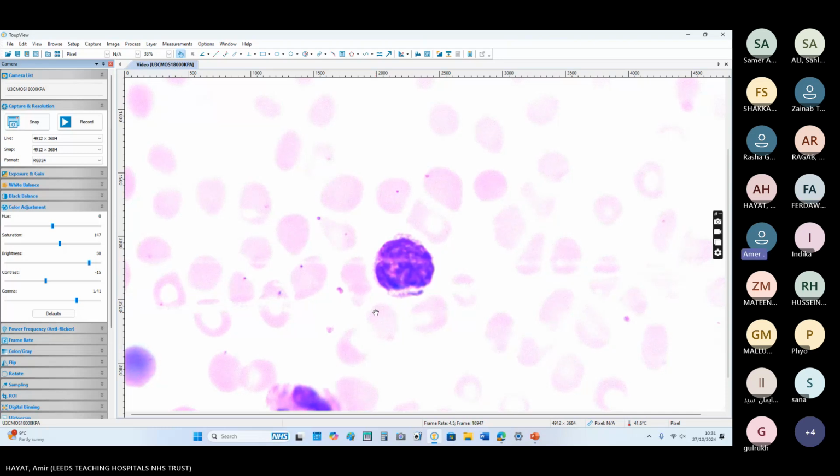If you have been given a history of eczema, eczema either goes with eosinophilia, so you will be thinking that maybe this is idiopathic eosinophilia, or associated with any myeloid disorder. Another, you would think maybe this is some type of worm. So you will see the slide on power 4 first. And the third cause of widespread eczema in hematology is Sézary syndrome. So you would prepare your mind to see these types of cells.